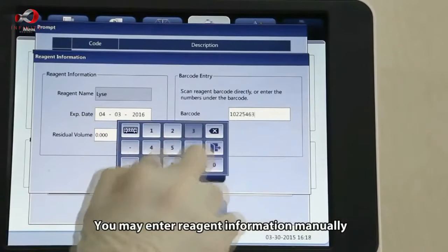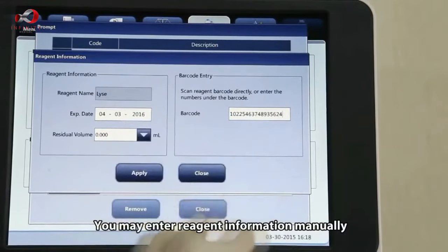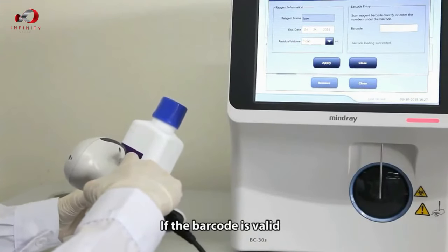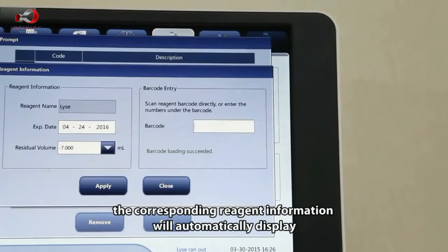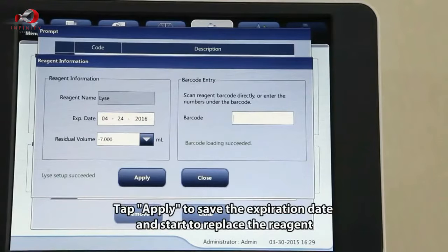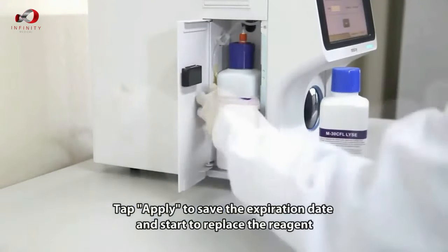You may enter reagent information manually or enter the barcode by scanning. If the barcode is valid, the corresponding reagent information will automatically display. Tap Apply to save the expiration date and start to replace the reagent.